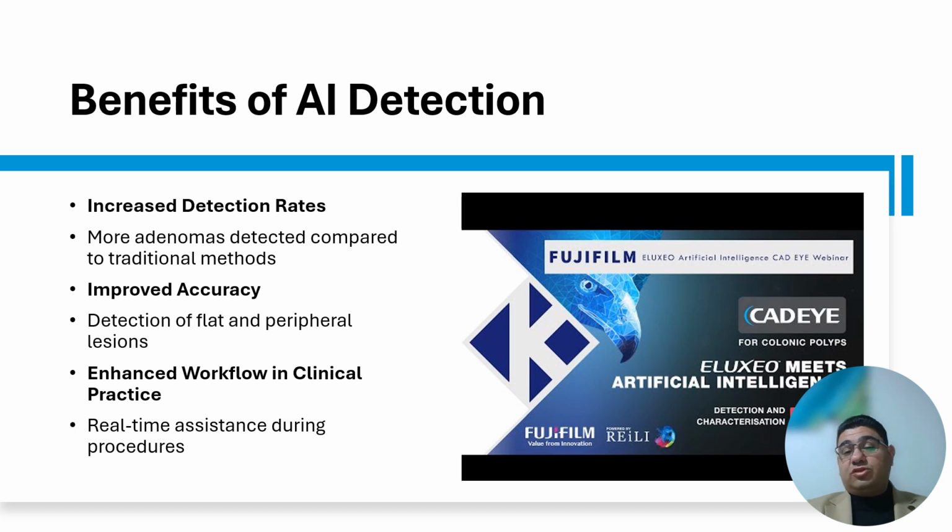But I think it is not accurate all the time, and it does not always give you a good optical diagnosis. The expert can do endoscopy without it. I think it is more helpful for younger doctors or for those who are in training, for more detection and more optical diagnosis of the lesion.